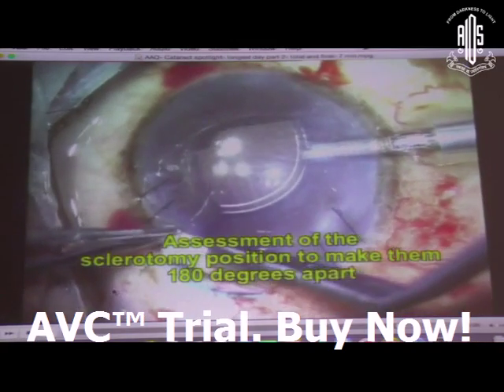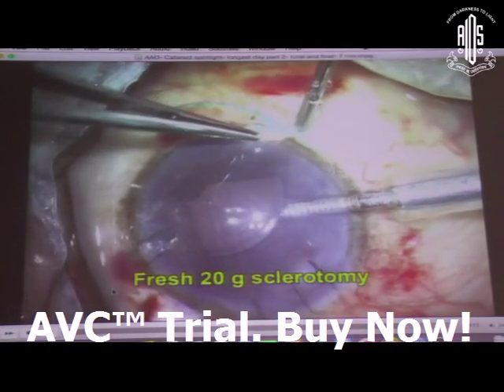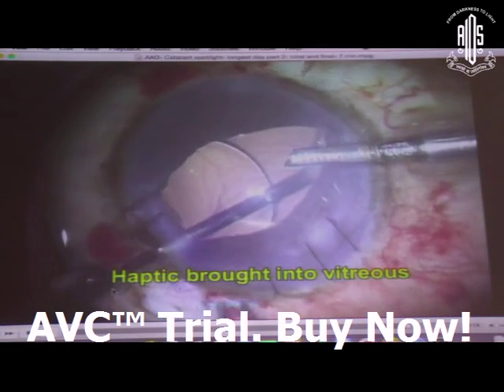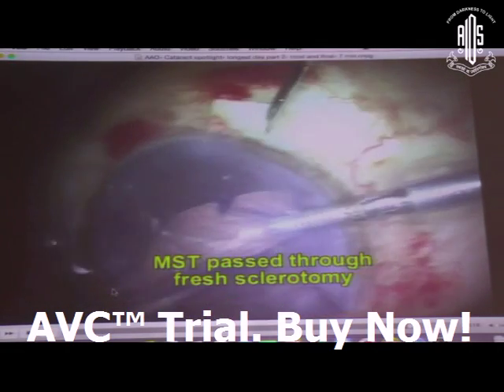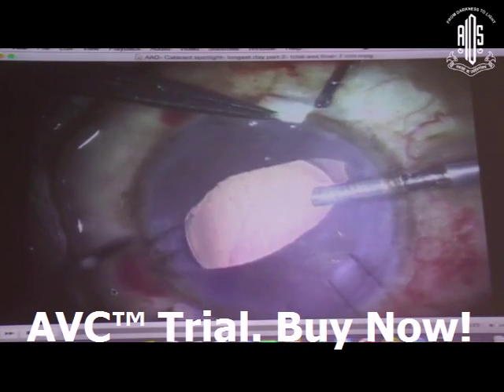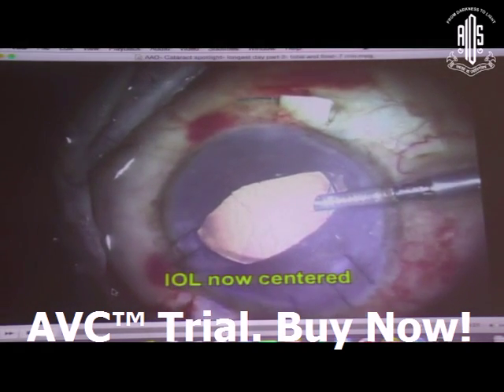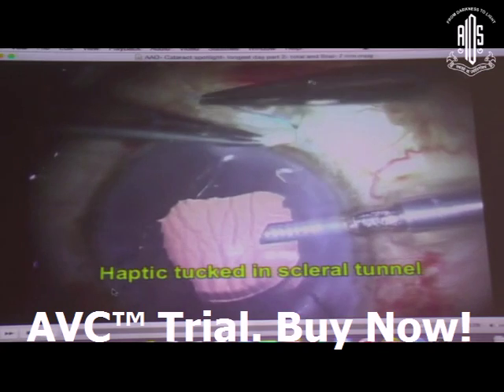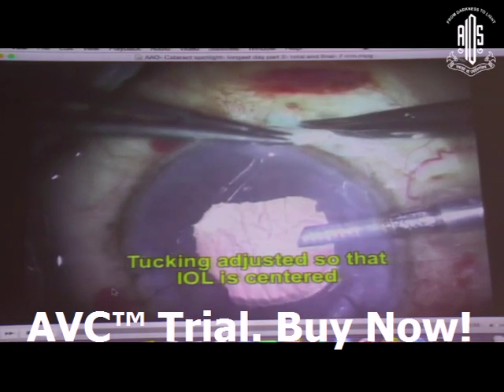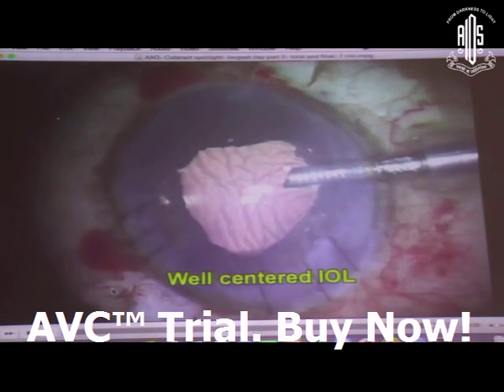Now I'm stuck. So what I decided now is to make a fresh sclerotomy matching the sclerotomy on the other side. Then I have to re-internalize the haptic. Once that's re-internalized, I will re-externalize the haptic, catch it, and now you can see the lens centered. At end of all this femtocataract which we started off with, you can see now the case getting some semblance of decency. So you can see now, I've just tried to tuck the haptics. I have a well-centered IOL.